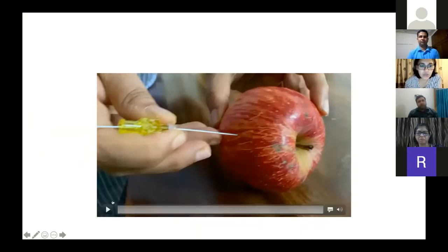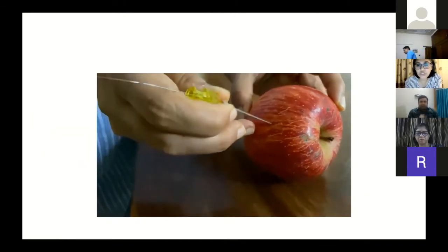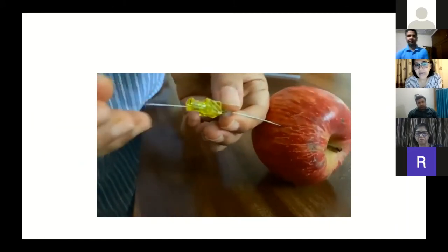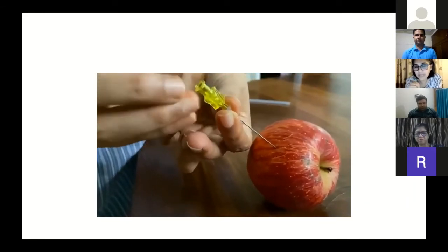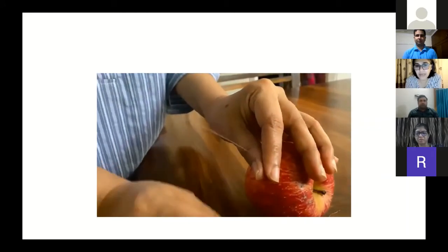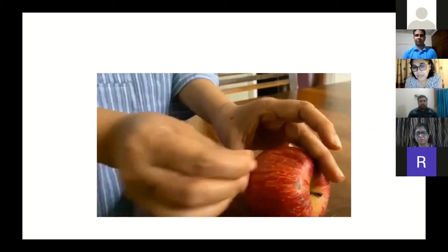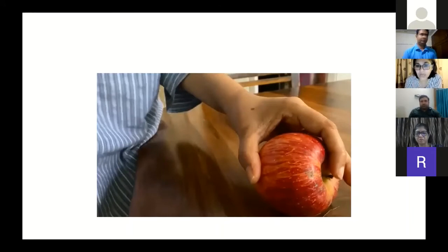This is a small demonstration of how it is done. I have placed the wire inside the needle, making sure that the tip of the wire is well inside the needle and not protruding from the side. Push the needle inside, and then once you are in the location, push the wire until you feel resistance. Once you feel resistance — meaning the wire is no longer going inside — gently try to remove the needle while pushing the wire inside. Once the wire gets engaged, you can see that it does not dislodge. This is a simple procedure; anybody used to doing FNACs of the breast can do it.